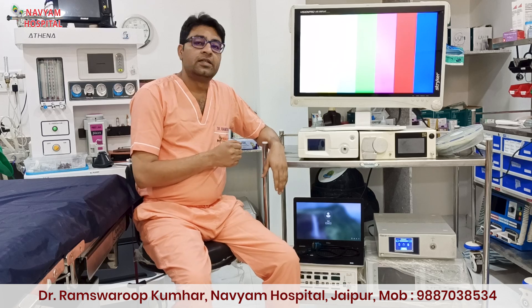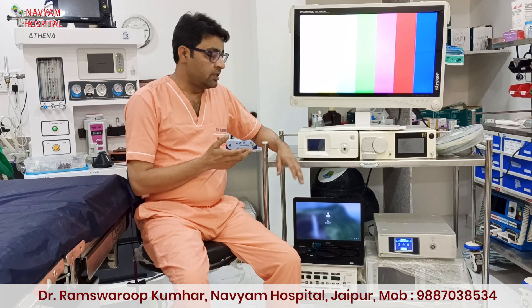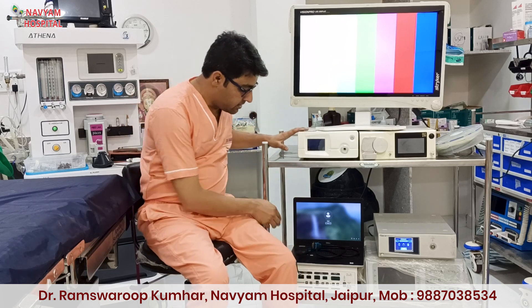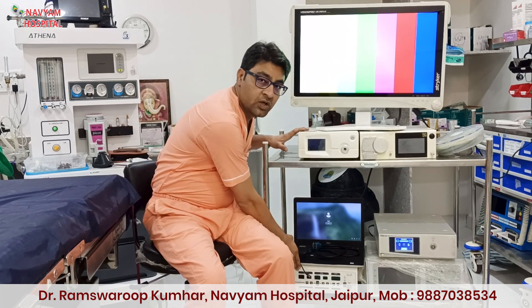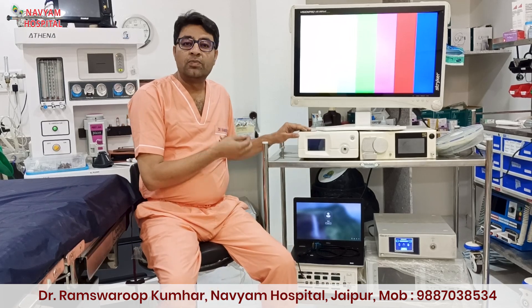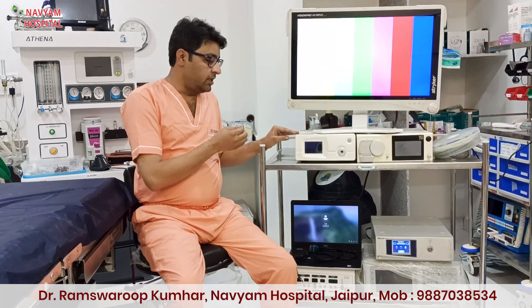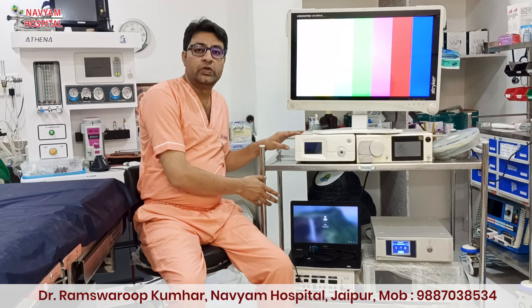The second thing is the light source and the CO2 insufflator. As you can see, this is my light source and this is the CO2 insufflator below. These are Indian products and very easily available. These both machines you can purchase within one lakh, in good condition. These are new — not refurbished.